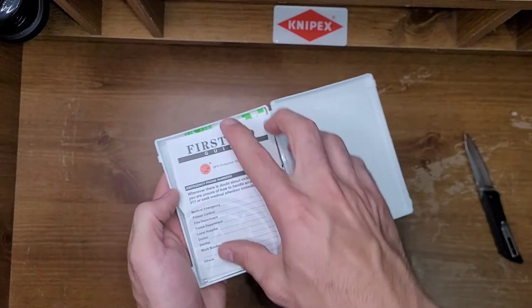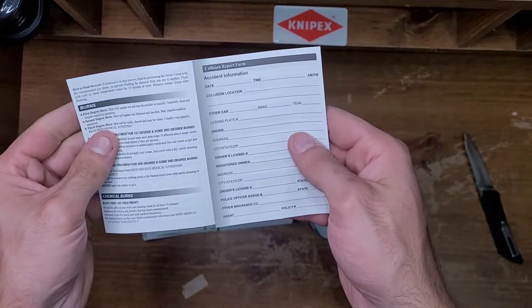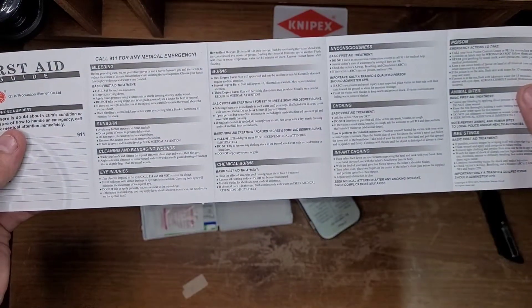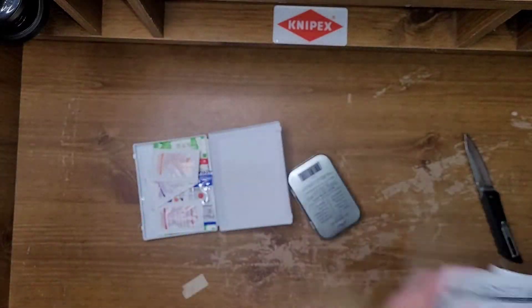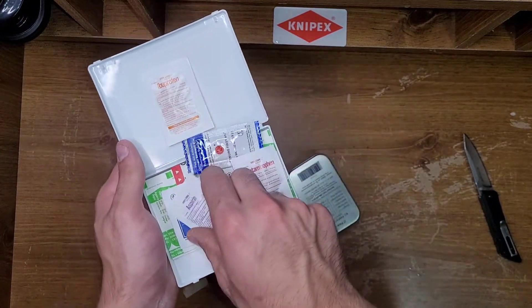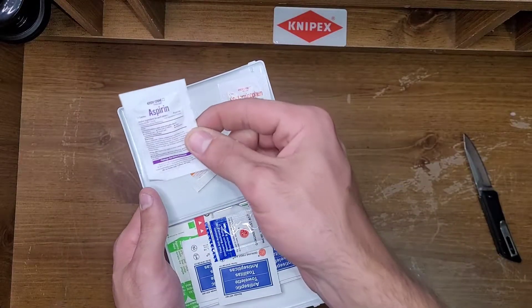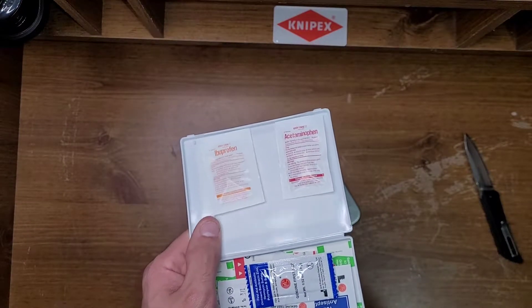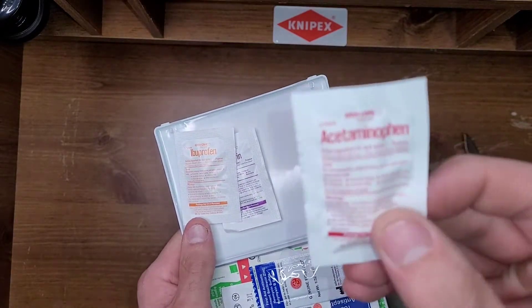First aid guide — look at that. Does it have any decent information in it? Animal bites, bee stings, bleeding, sunburn, cleaning damaging wounds, emergency phone numbers, 911. Oh, ibuprofen — that's neat. Pills: aspirin, ibuprofen, acetaminophen — there's two in each. Aspirin is 325 milligrams a piece, ibuprofen is 200mg, and acetaminophen is 500mg.